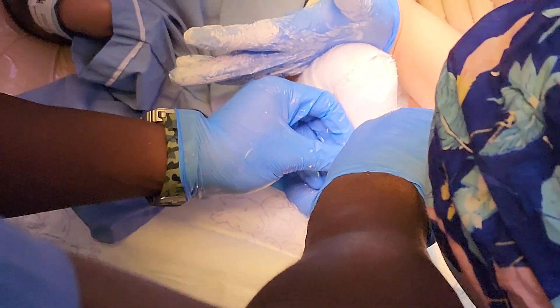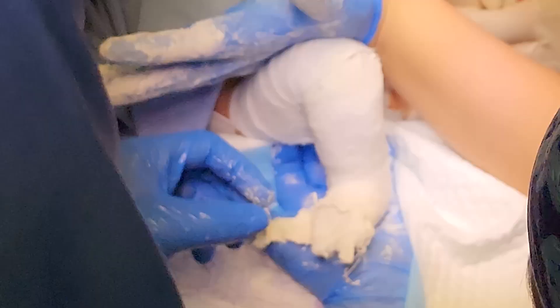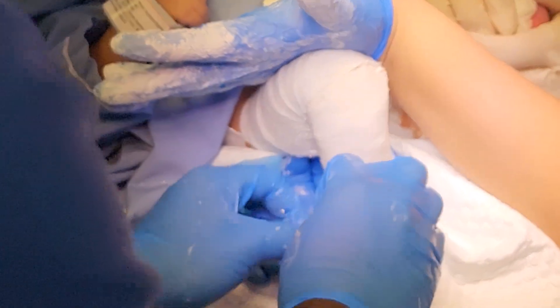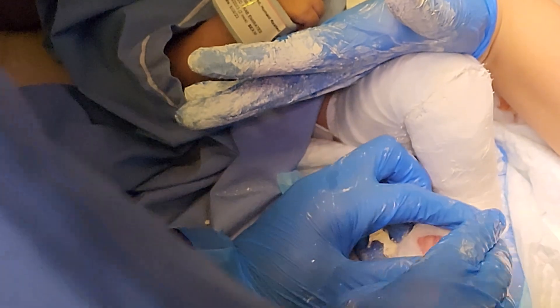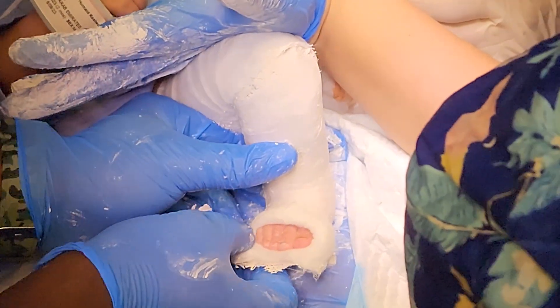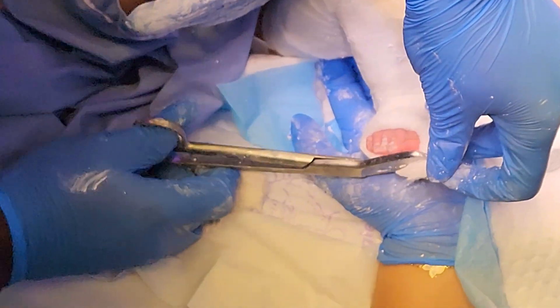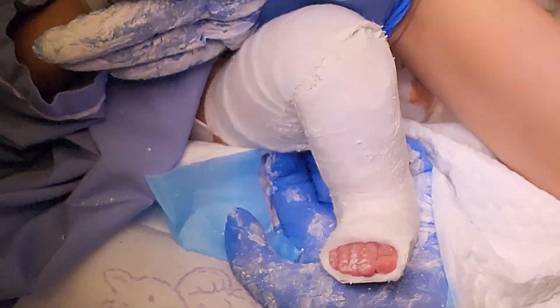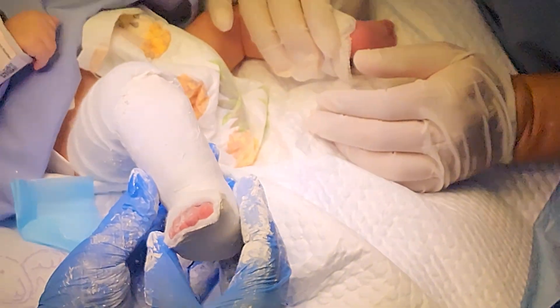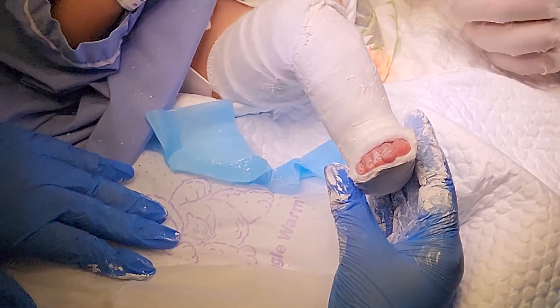Once we complete the tenotomy and before the cast is fully set, we trim around the toes to expose them. The tops of the toes should be completely free, but the platform underneath the toes should extend to the end of the toes to prevent curly toes. This is a two-person procedure: one person holds the foot and the other applies the plaster. An experienced plaster technician is really important for good results. We finish the below-knee part, then extend it above the knee, keeping the knee at around 90 degrees or slightly more of flexion.